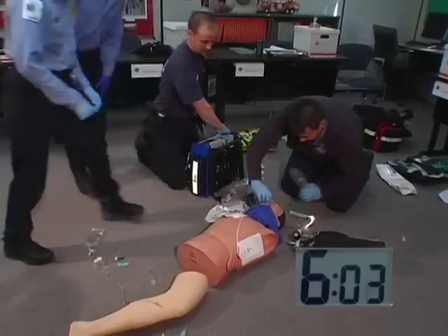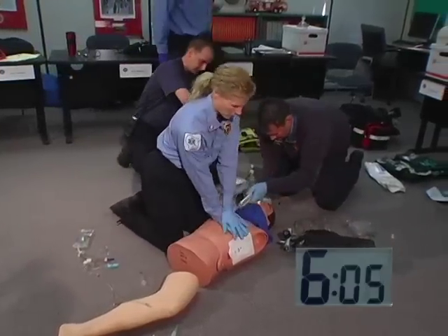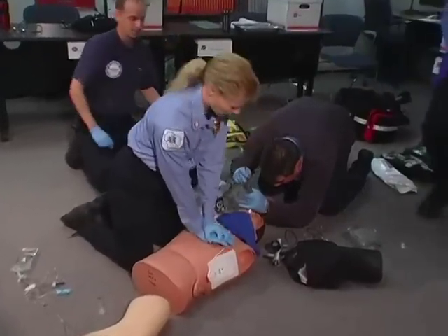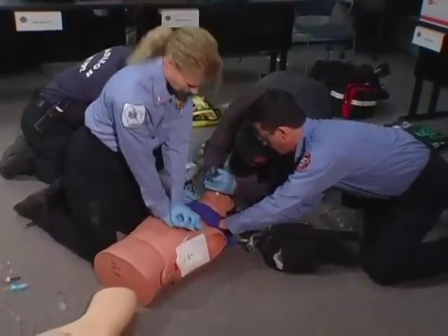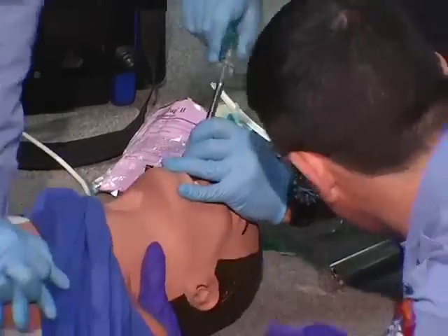Okay, oral airway coming out. George is going to take one quick look. It's mandatory to have some assistance in stabilizing the neck while chest compressions are ongoing to give you the best opportunity of success during your intubation so you don't have a moving target.